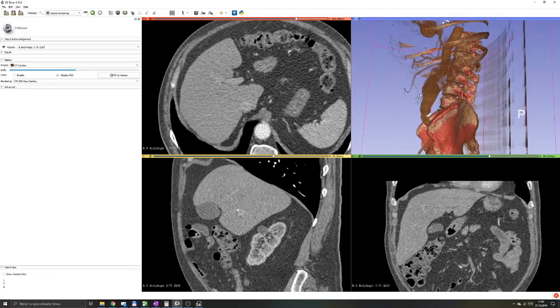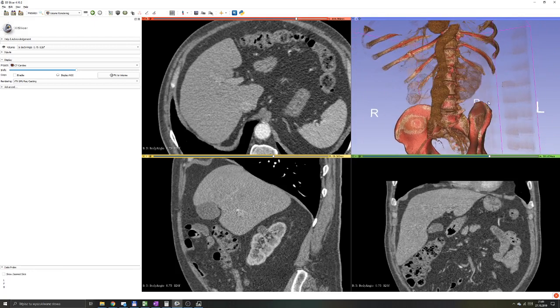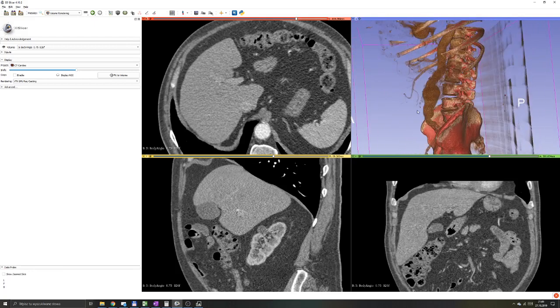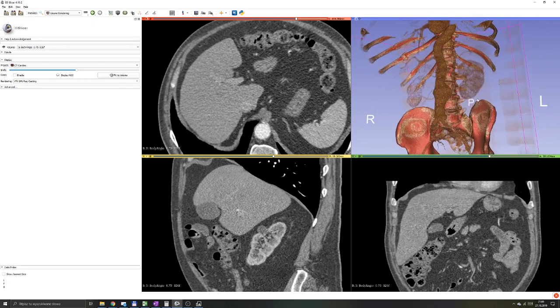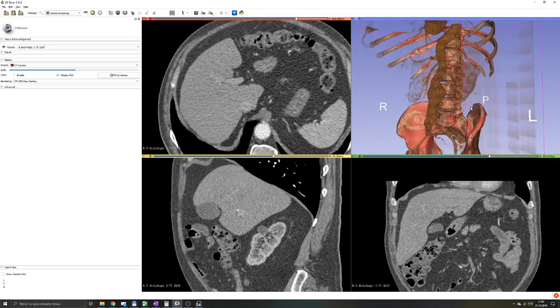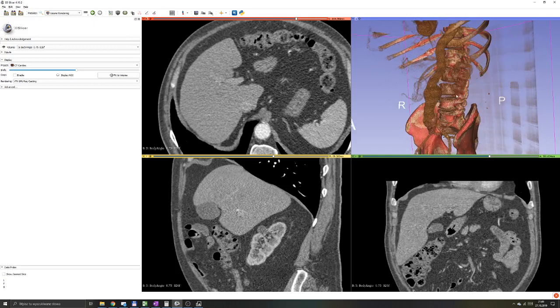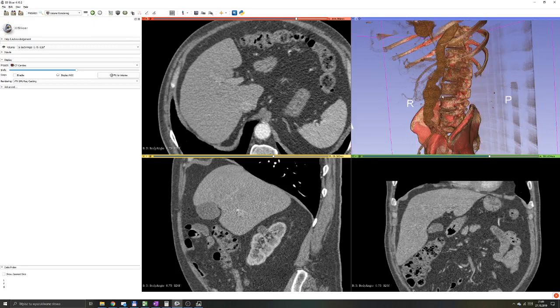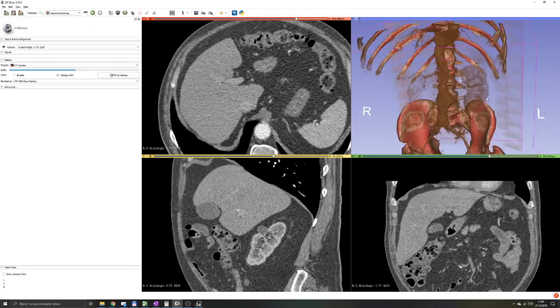You might be surprised because you can see the aorta and it took you probably two seconds to see that. But this is not a mesh, it is not exportable, and it is not 3D printable. There are no algorithms to make a 3D model or to 3D print straight out of volume rendering.